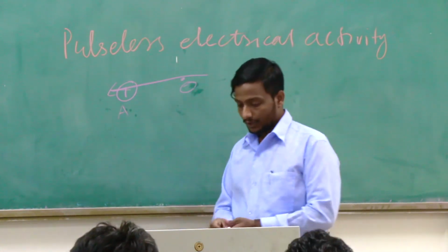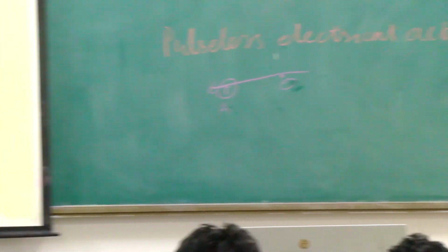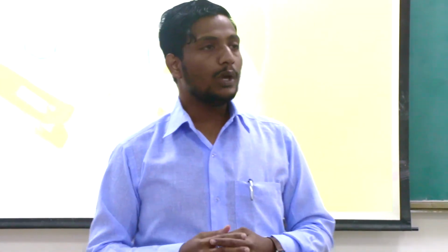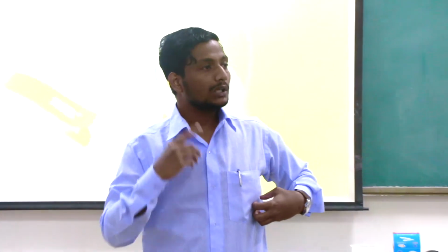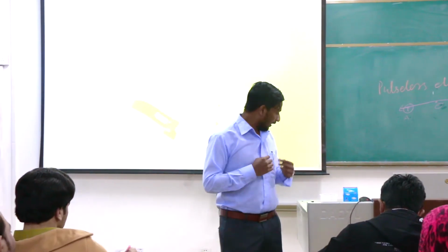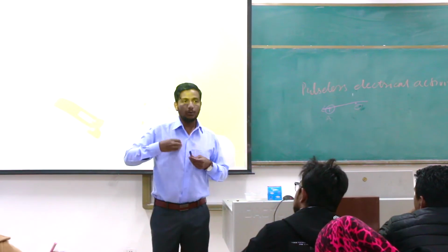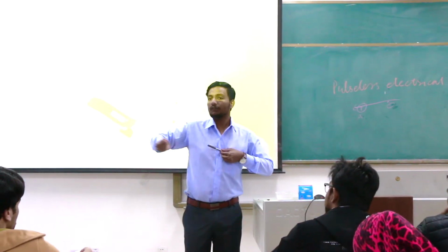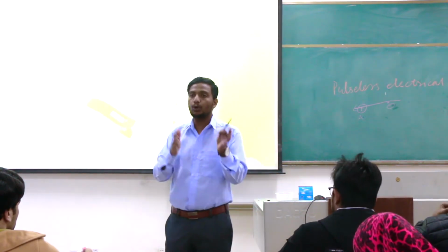So let's say that we have these chest electrodes. Are the chest electrodes an example of working alone or working in a group? Working alone. So when we place these chest electrodes from V1 to V6, they work as positive, and the center of our heart works as negative. Suppose this is the axis for V1; then the axis originates from the center of my heart and goes toward V1. Are you getting the idea?